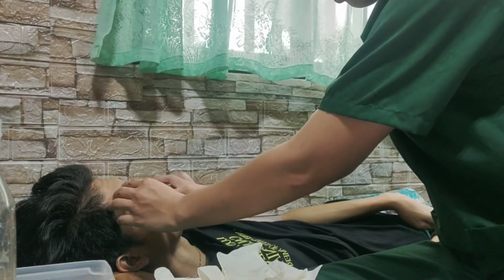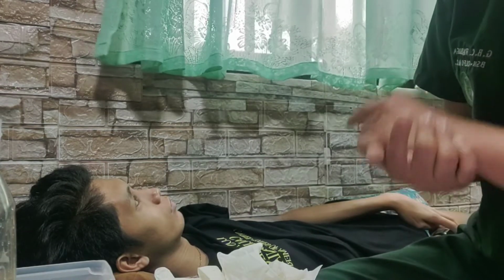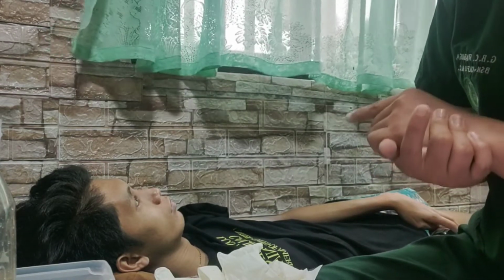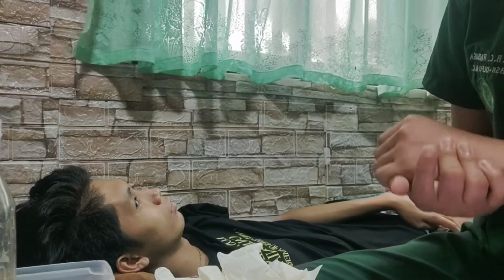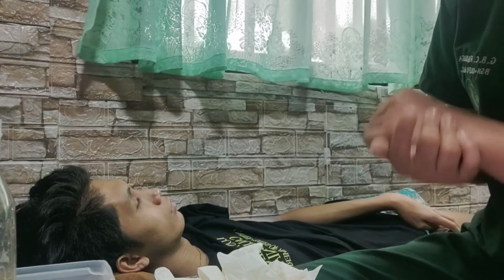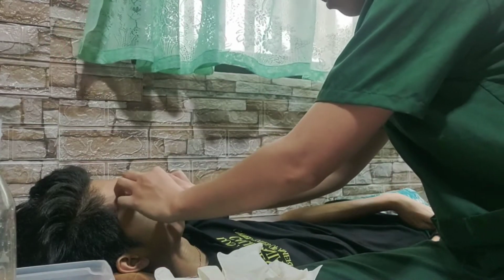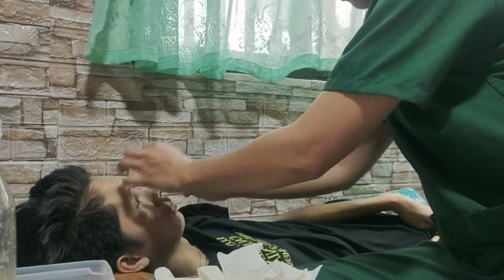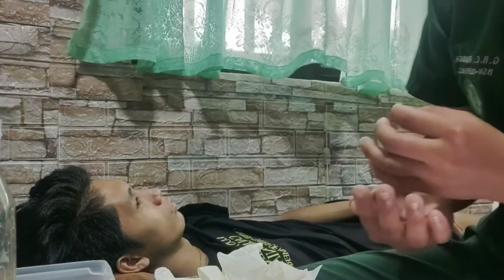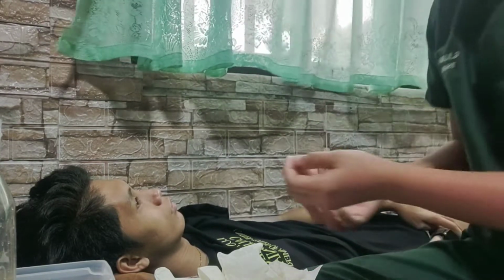Okay, thank you, sir. Next, gently touch the surface of the contact lens with an index finger and make sure the lens is centered correctly in the eye. Then pull the lens away from the eye. Sir, I will pull out the lens. Okay. Next, repeat for the other eye.